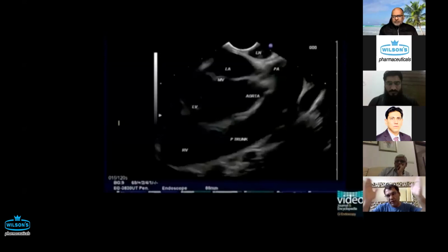So rotating clockwise looks at the right side of the patient's body, but on your monitor it appears on the left side. It's the same the other way: when you rotate anti-clockwise, that looks at the patient's left side, but on your screen it's the right side. These are the things regarding anatomy and orientation of the scope.